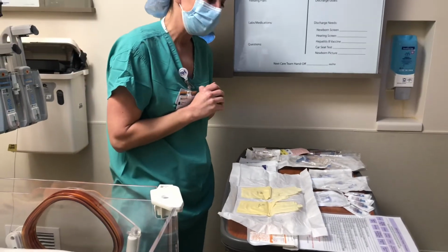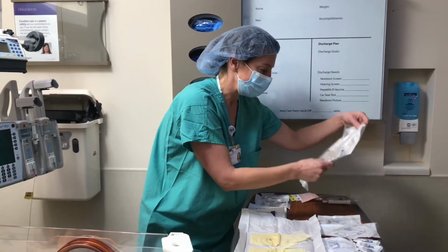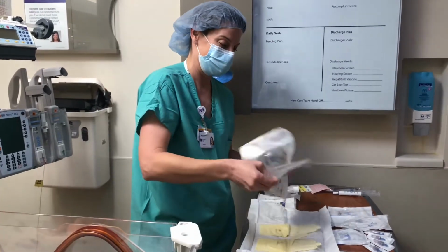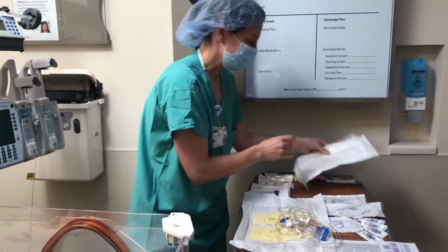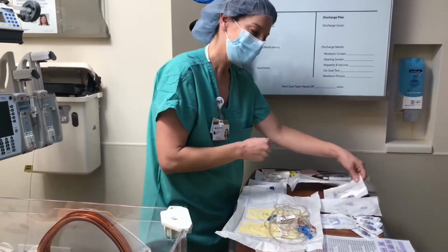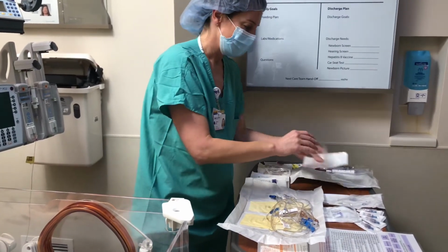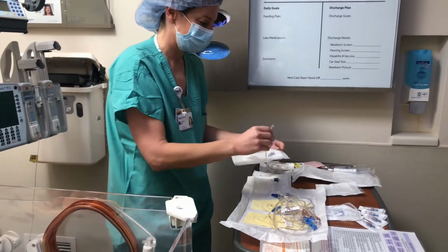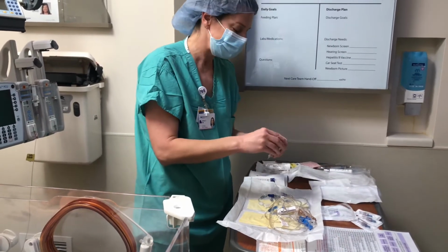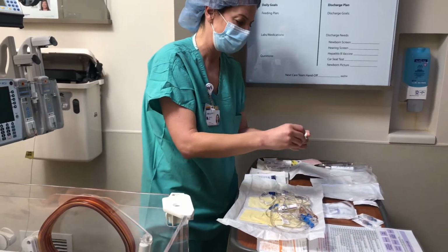Next, I'm going to start opening my supplies onto the sterile field. Now, some of these are already open, so let's just go with suspending disbelief that these are sterile that I've opened. Okay, so I'm opening my IV tubing, and we're going to simulate that that is all on the field. Next, I'm going to open my TPN filter, my lipid filter. I'm going to open up all my microclaves, and again for this type with TPN and lipids and a medline, I'm going to need 4 of them.